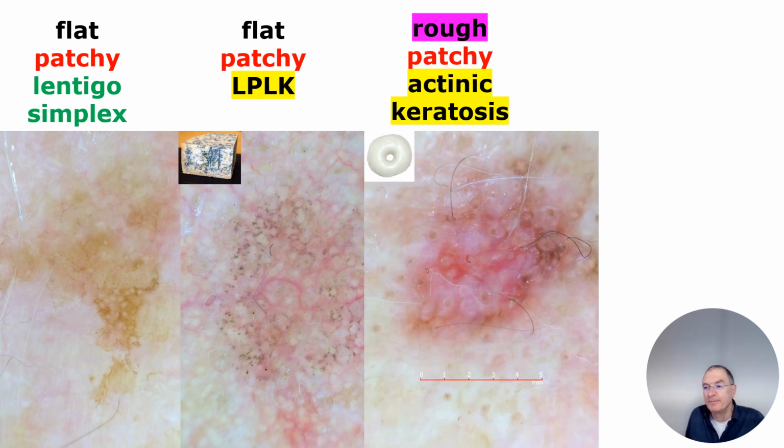Well, it's nice. Rough in touching, and very important, we see initial whitish donuts. And remember, whitish donuts are a sign for a keratin producing tumor. That means the actinic keratosis is going to switch into the SCC, squamous cell carcinoma. Local treatment, yes. Control in 3 months, yes. And if there is some remaining part which is painful, we know the last painful island, that we have the SCC, squamous cell carcinoma.